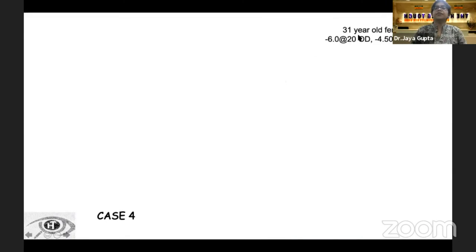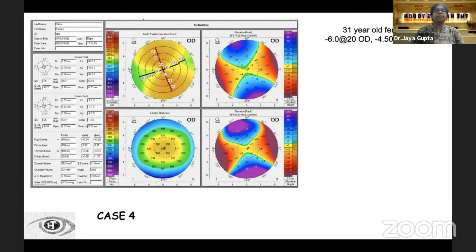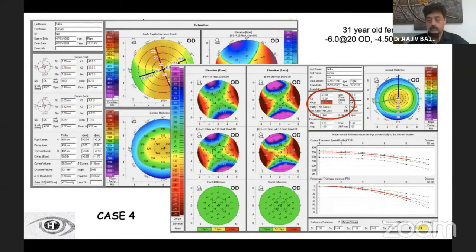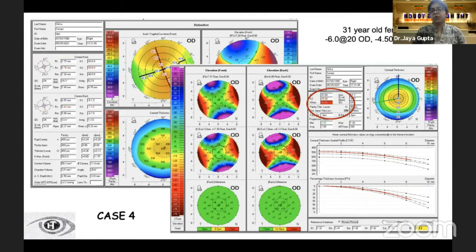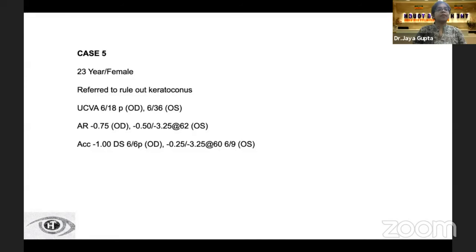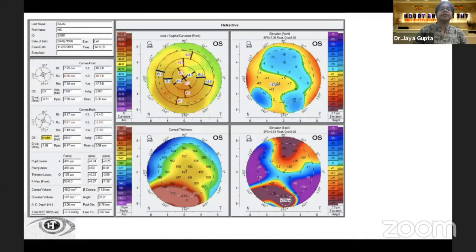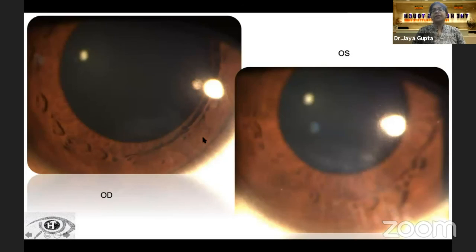Case 4: a 31-year-old female with a refraction of minus 6 cylinder in the right eye and minus 4.5 cylinder in the left eye. The quadmap looks fairly normal, but the Kmax shows 50 diopters. A Kmax of 50 diopters does not essentially mean a keratoconic eye. Case 5: a 23-year-old female referred to rule out keratoconus, with refraction of minus 1 diopter in the right eye and minus 3.25 cylinder in the left eye. The map shows inferior steepening in the posterior elevation with values of 70 microns — but on closer look at the cornea, we see an inferior scar in both eyes, which explains all the abnormalities seen.